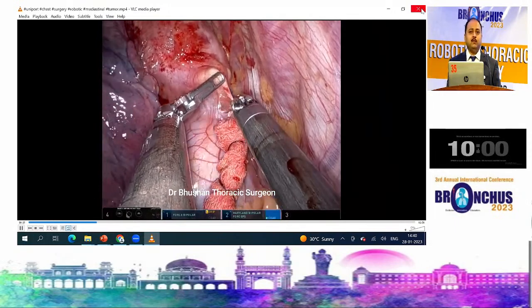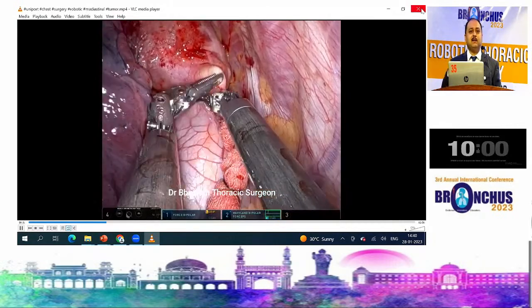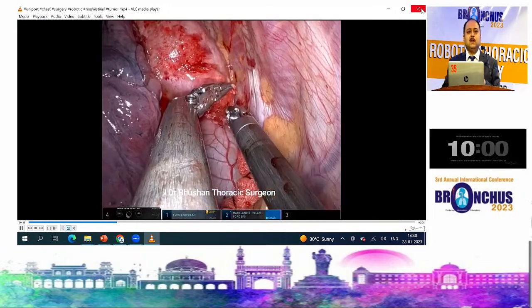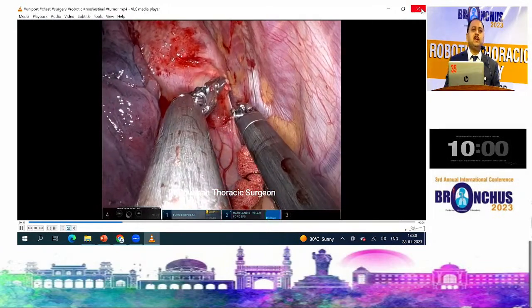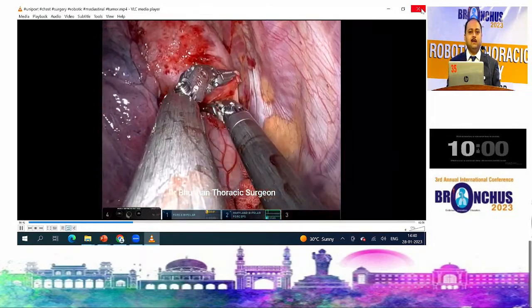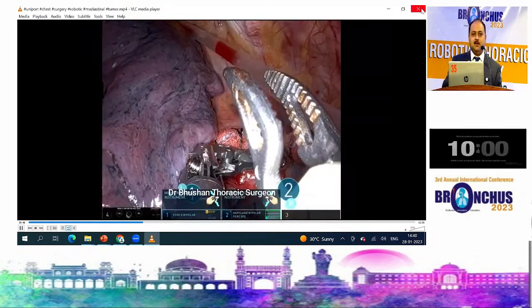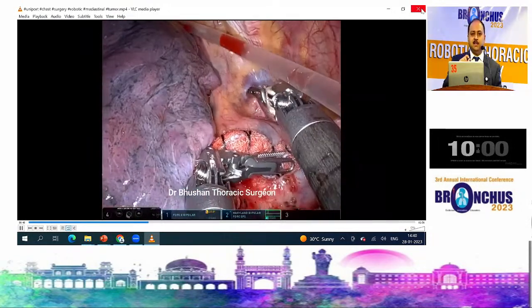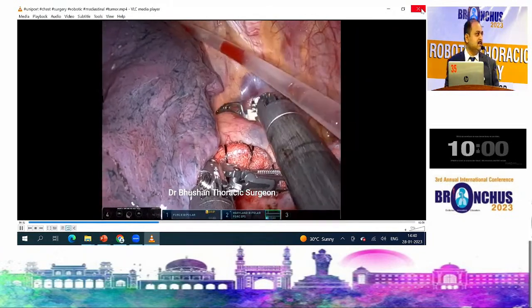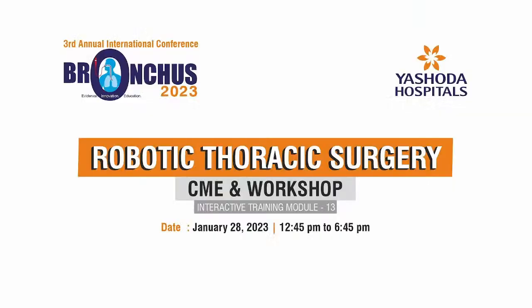Is there any other alternative, if not Ethibond? Proline, but the problem with proline is that the suturing becomes difficult. I have attempted with proline and struggled almost 1 hour because it used to get loose, and then you have to recut it again. Ethibond at least has a grip. And my assistant can always pass a suture passer through the utility incision, tie the knots outside and pass them inside. Thank you.